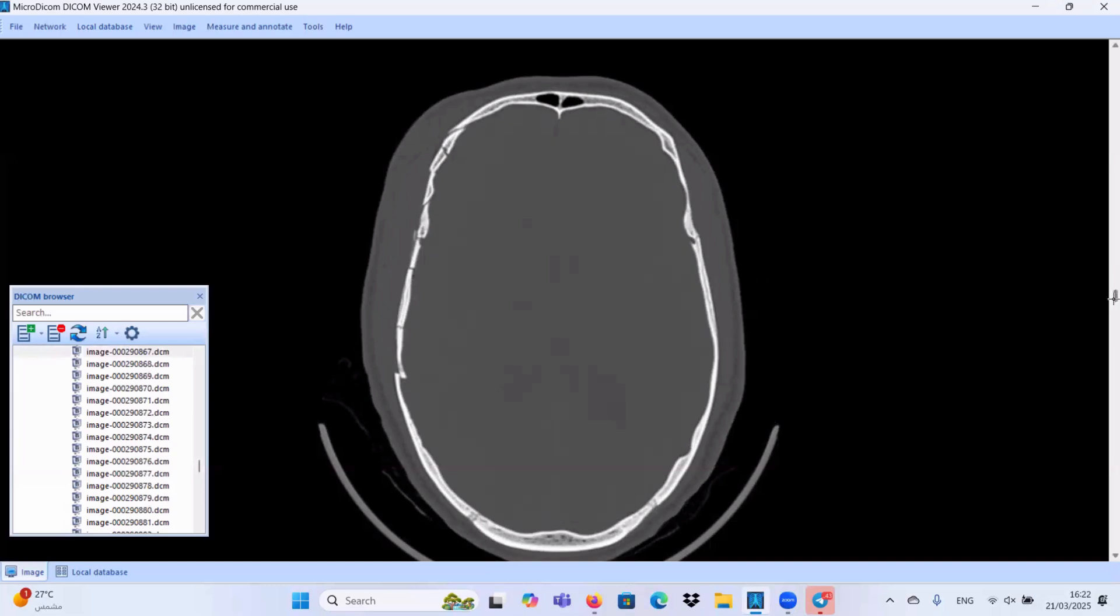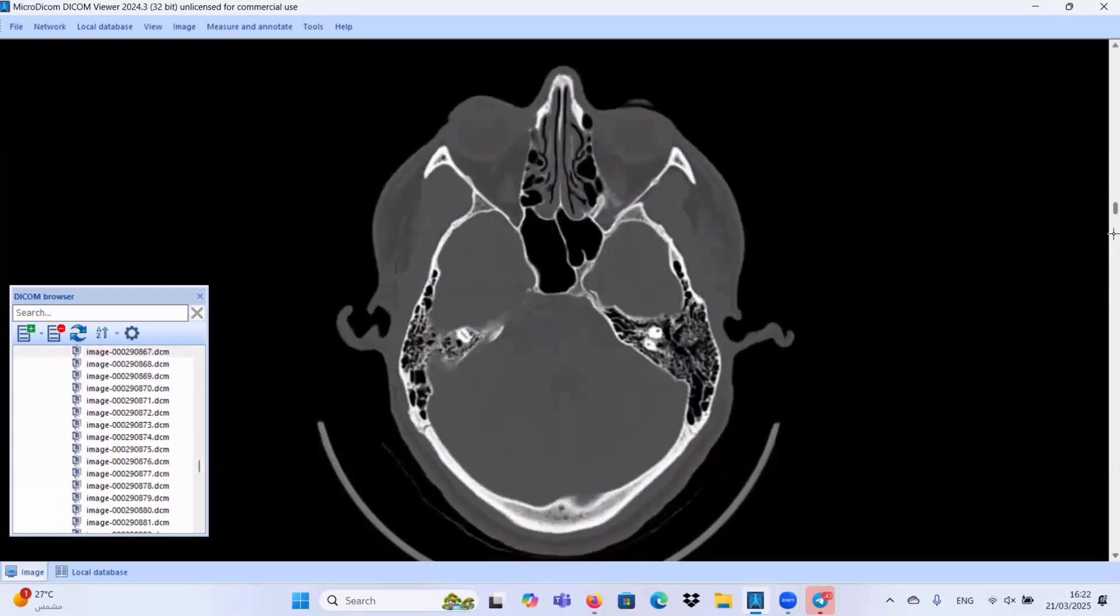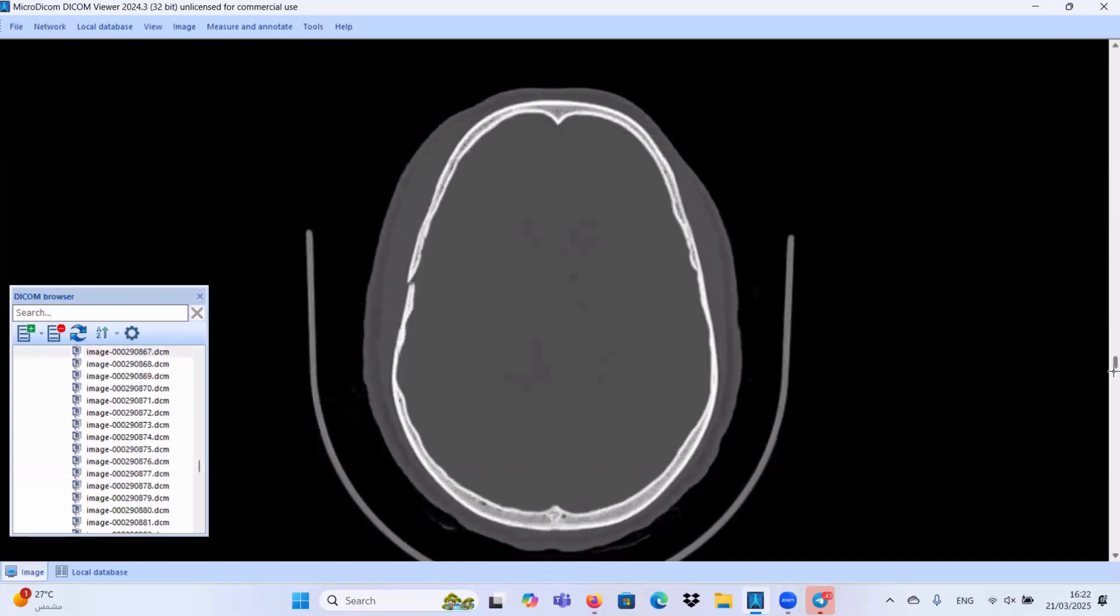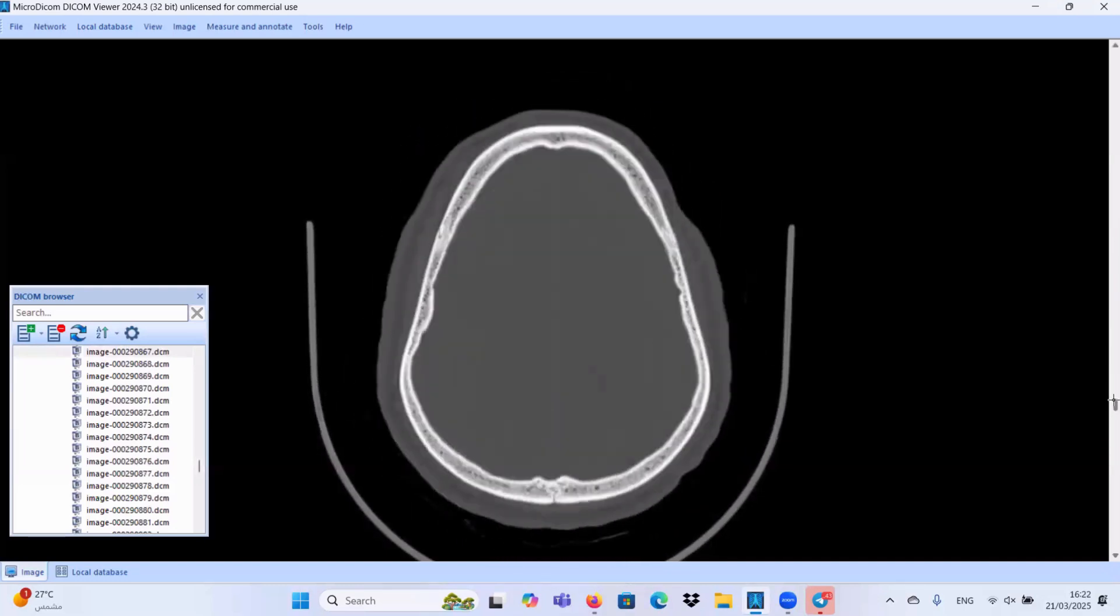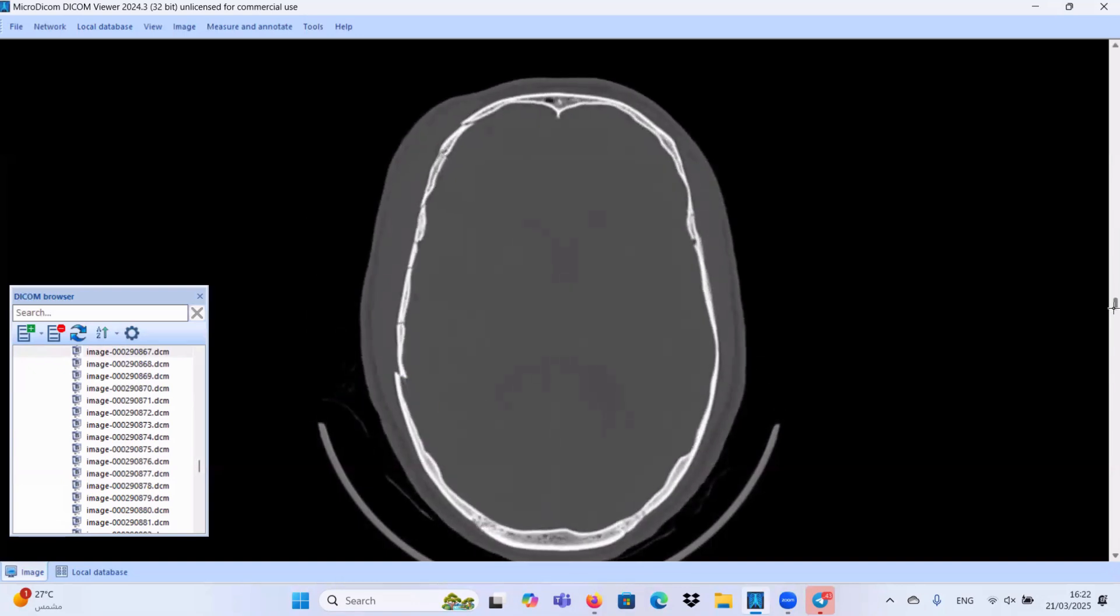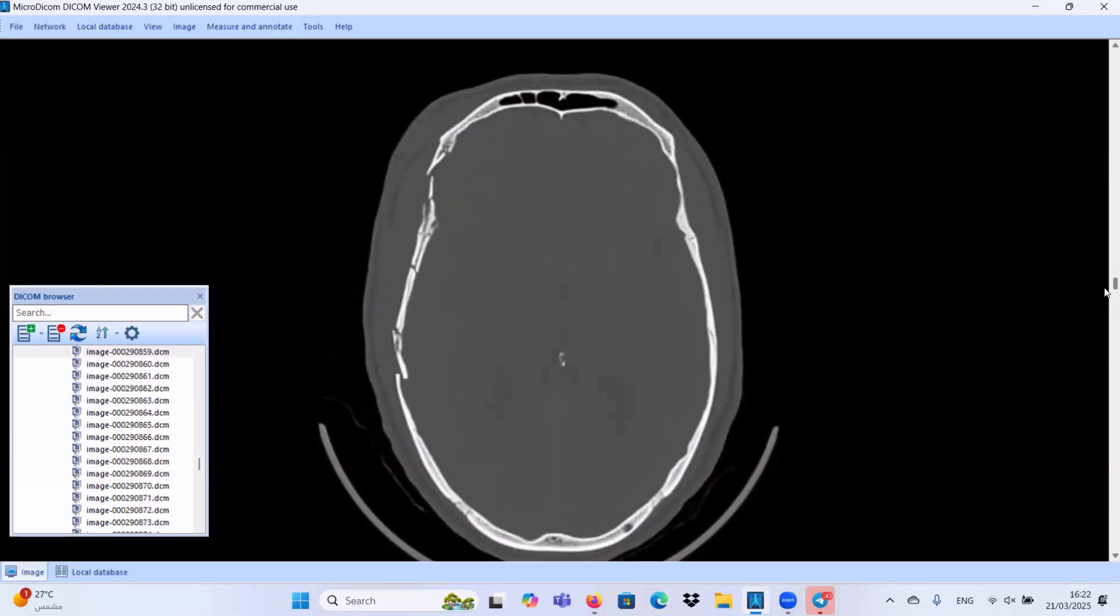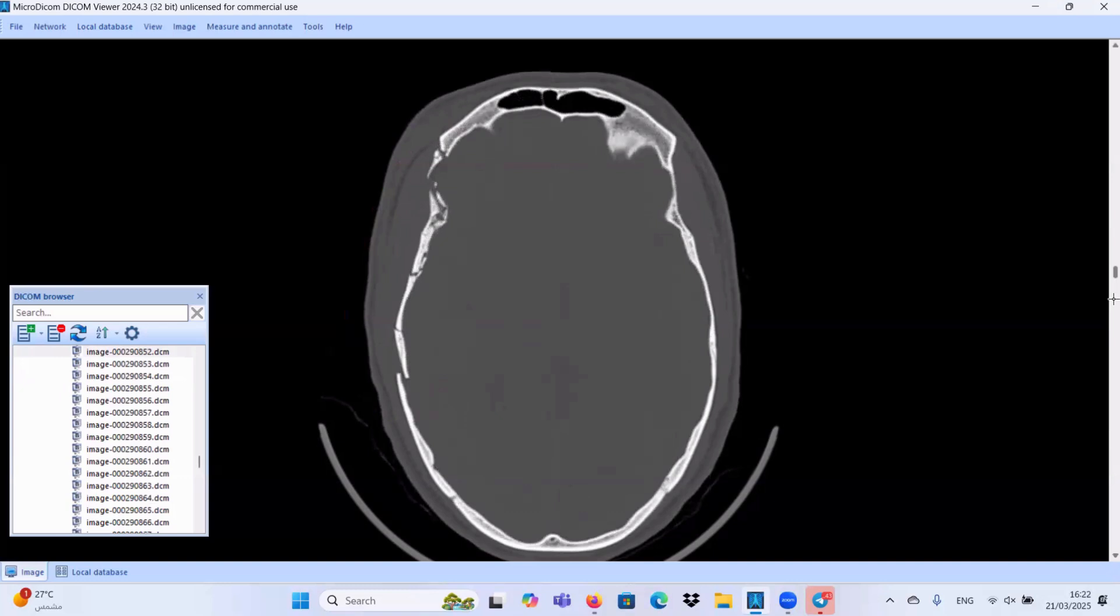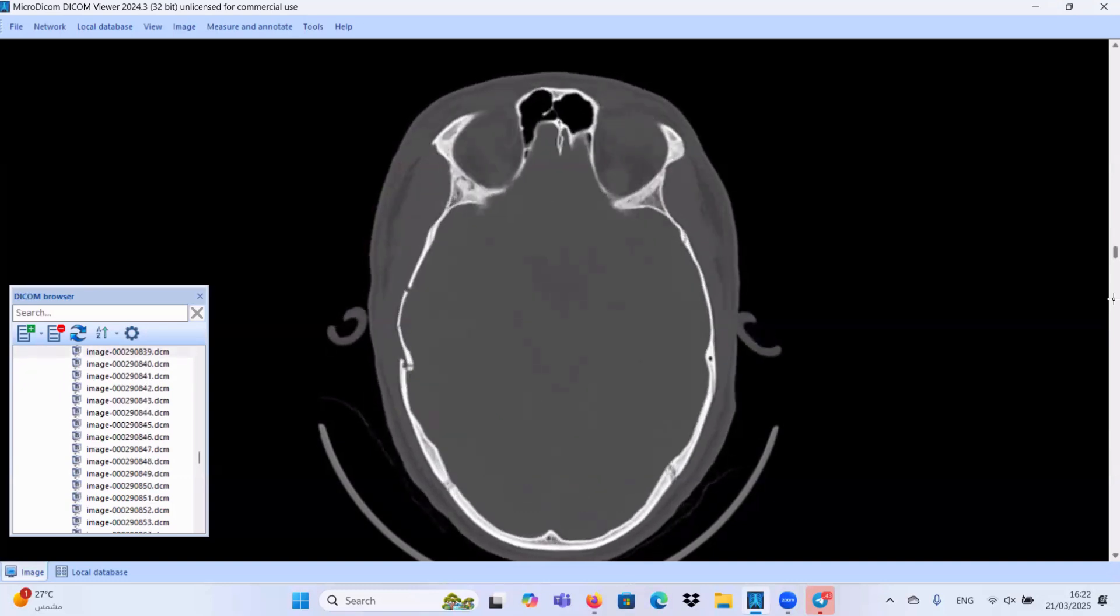Let's start by the first case, young adult patient with history of RTA, road traffic accident. Let's start by the bone window. We have comminuted depressed fracture involving the right temporal parietal calvarial bone. And this fracture, as you can see, this depressed fracture.